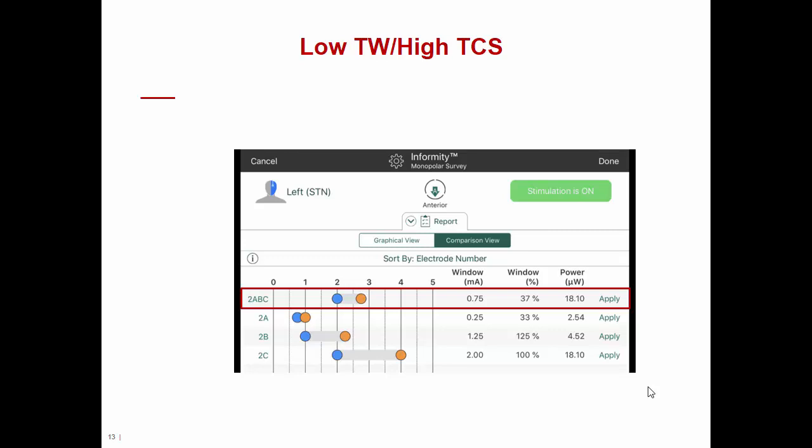The third parameter to analyze is power consumption, which Informity calculates automatically by evaluating the impedance of the specific level of stimulation — in this case the average of the co-activated ABC contacts — and calculating how much power is needed for that configuration. The power analysis of the 2ABC configuration shows suboptimal power consumption. In summary, the 2ABC configuration has a small therapeutic window, a low window percentage, and relatively high power consumption, making it a suboptimal setting despite appearing acceptable at first glance.